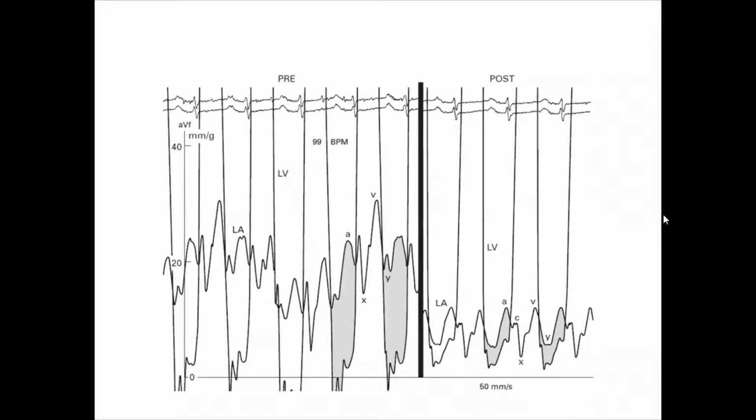So if you see a difference in the heart rate between the left side and the right side, that might be the answer. You are absolutely right, Hakim. But if we have this tracing in the cath lab and it is written pre and post, for example, said procedure, most likely valvuloplasty. But if you notice a significant drop in the heart rate between pre and post, this may be an effect of the beta blocker. So pay attention and be open-minded for all possible interventions, maybe medication or procedure. Thank you, Hatim.